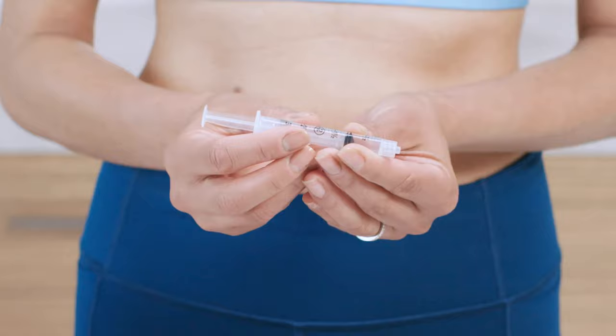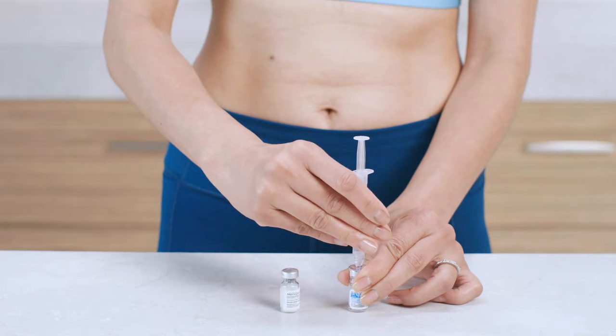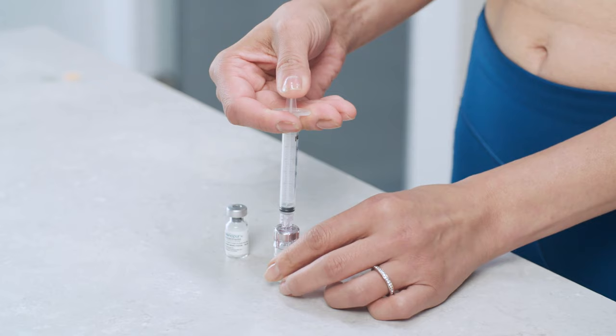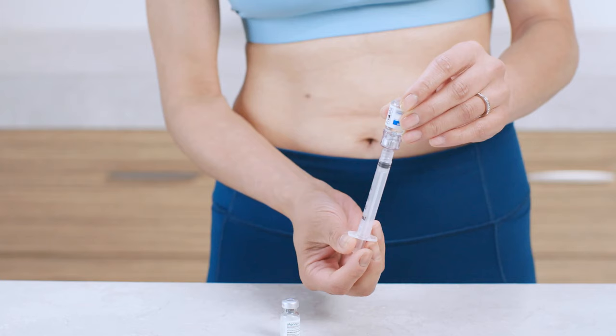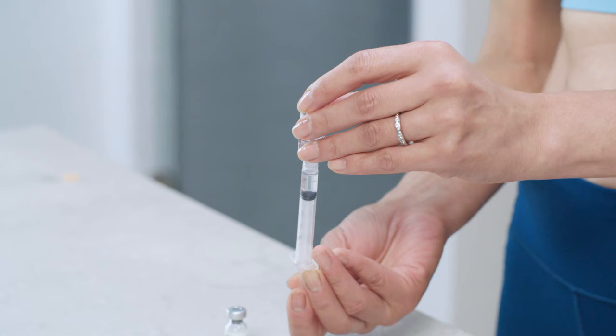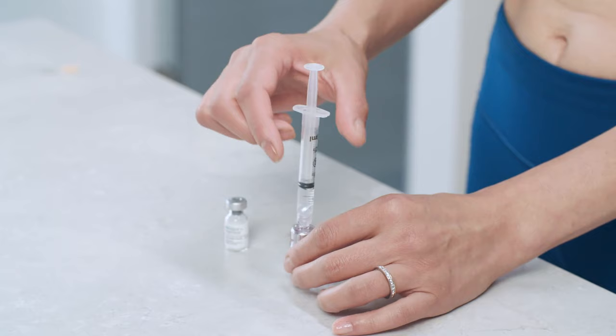Place the tip of the syringe into the connector end of the Q-Cap and twist clockwise until it's tight. Gently press the plunger all the way in, which pushes the air into the vial and makes the diluent easier to withdraw. Without removing the Q-Cap, turn the vial upside down and slowly pull back the plunger to withdraw the recommended amount of diluent. Then turn the vial right side up and pull on the syringe barrel to remove both the syringe and Q-Cap from the vial as one unit.